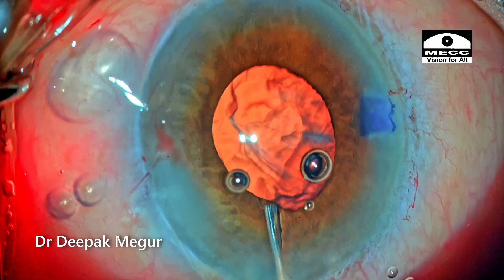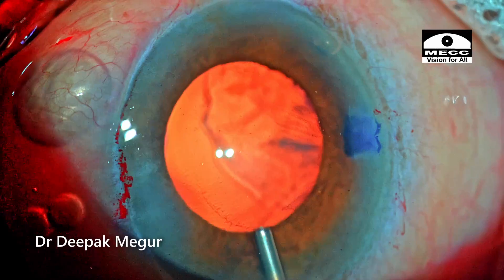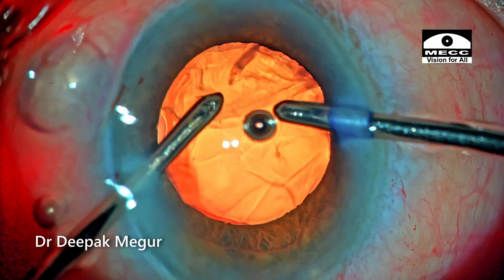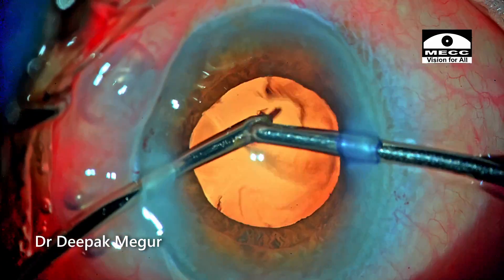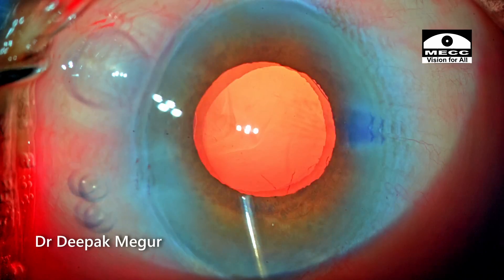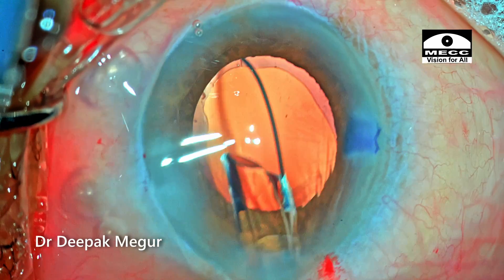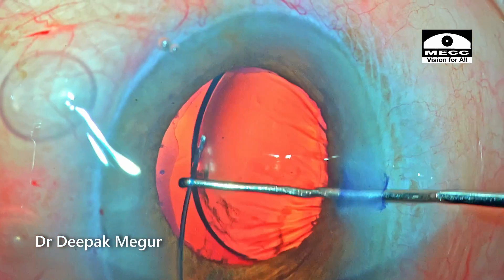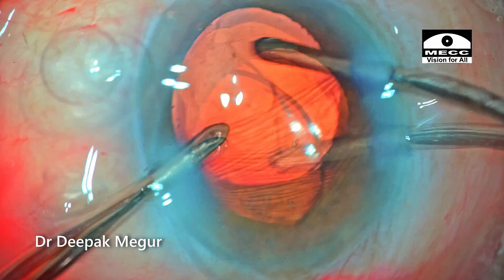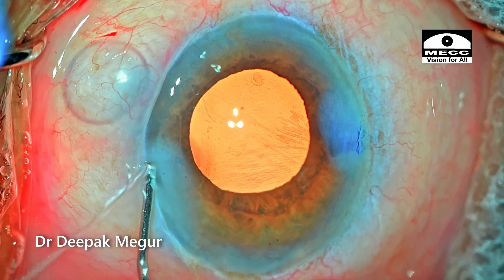When the eye becomes soft, the pupil decreases in size, which is a concern, but as soon as I inject viscoelastic the pressure causes the pupil to expand again, giving better visualization. Very little cortex remains and it is aspirated out. The posterior capsule is polished using a jet of BSS. Time to implant the lens — a multi-piece hydrophobic lens is implanted into the bag under the cover of viscoelastic. Once the proximal haptic is dialed into the bag, the OVD is removed from both in front and behind the lens. The side ports and main incision are hydrated.